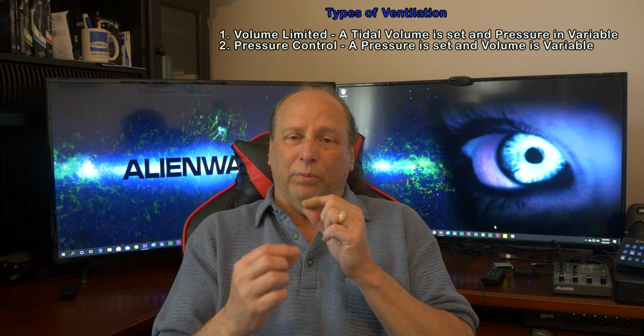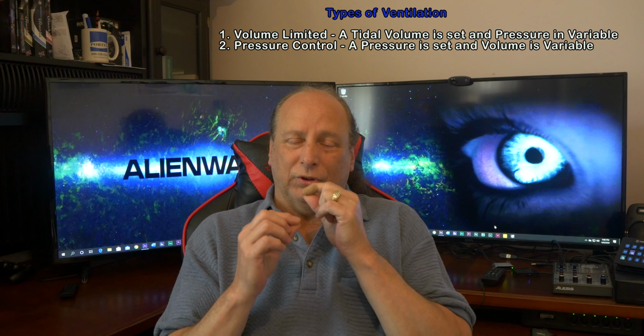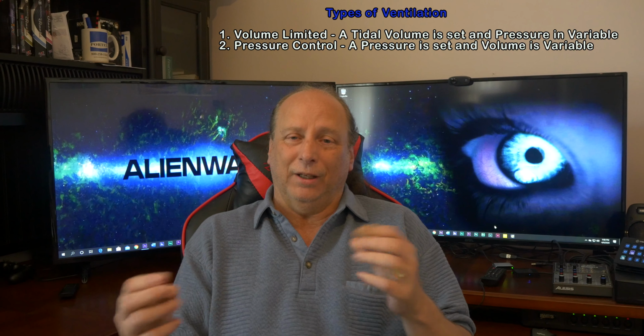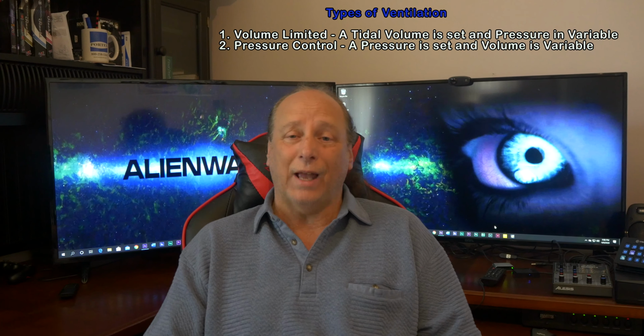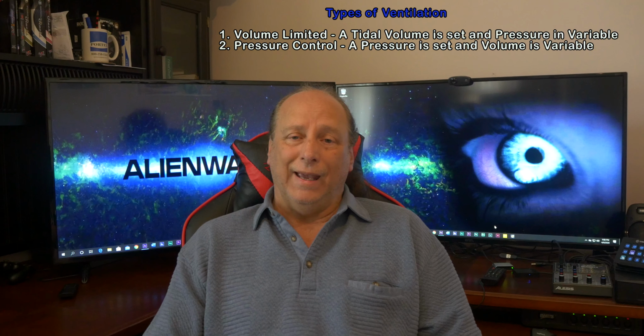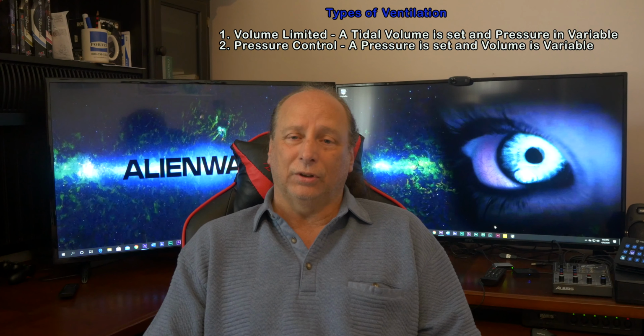You remember the trick with the brand new balloon? It's real stiff and you have to blow real hard. It takes more pressure, but it doesn't give more volume. It gives the volume you give. That's why we stretch them out and make them loose, and then the pressure takes a lot less to open it, so the balloon is more compliant. That's exactly the same thing with a lung. So these COVID-19 patients get real stiff, and so it takes higher pressures to get a volume.